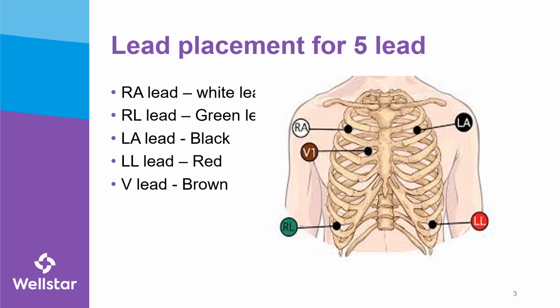A lot of people will say, can it go on the arms or can it go on the chest? I would say to minimize artifact and movement, put it on the chest. Either choice is appropriate as long as they are matching. So don't put the left one on the arm and the right one on the chest. Just ensure that they are symmetrical.